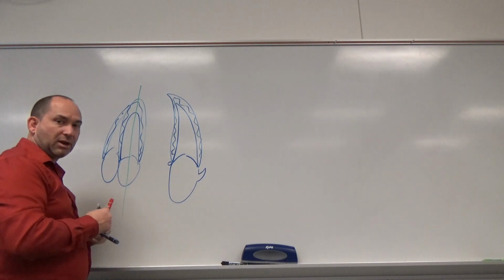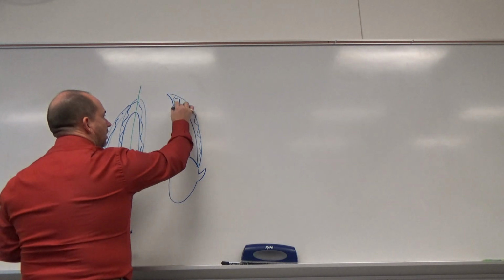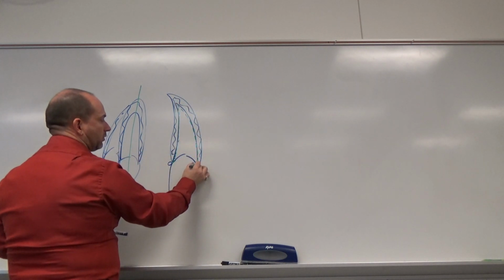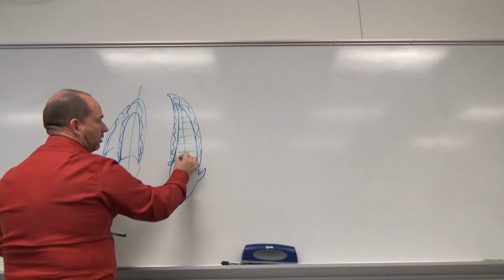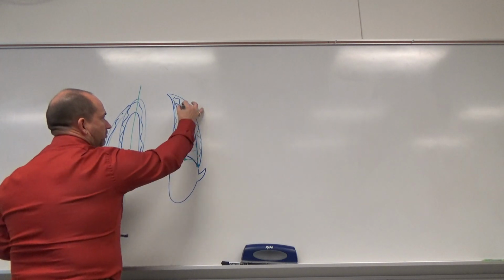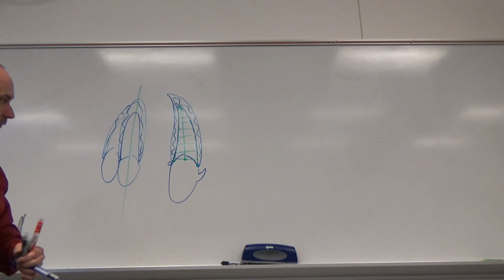We may take another volume of the atria, and we're going to take a Simpson's of the ventricle. This is the biplane, this is the other plane that we use. So Simpson's again, all the way through the apex. See those inner walls well. It does those lines. Maximum distance across. And that gives us the other part of the Simpson's and completes that formula.